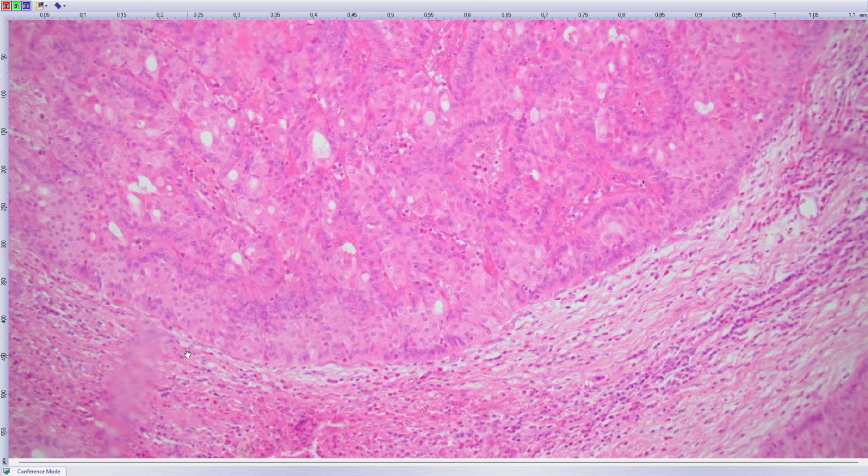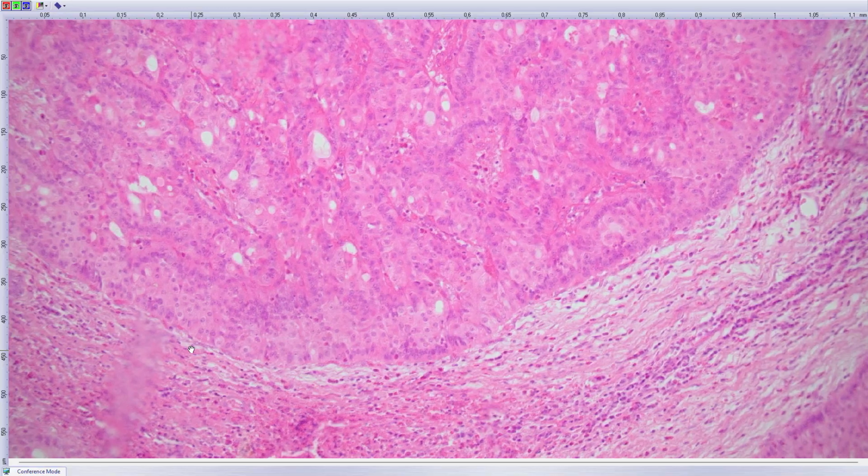Yeah. In kidney, these tumors, papillary carcinoma with reverse polarity, are always KRAS mutated, and now there appeared the first major methylation profiling map of methylomas, and they found that these tumors cluster in an entirely different place than the rest of papillary carcinoma. That means it is a real tumor, and it is as well oncocytic like this one. Yeah. So I would like to know. I would like to have more of these cases.